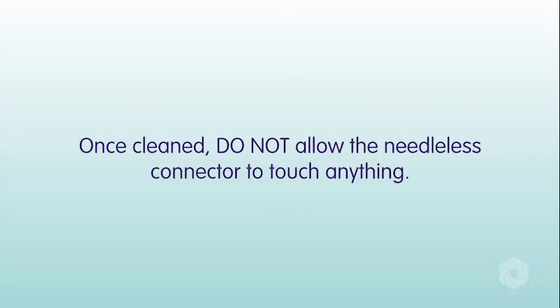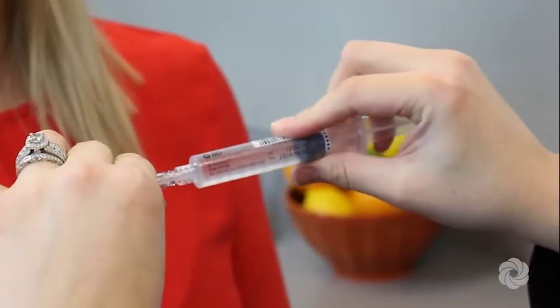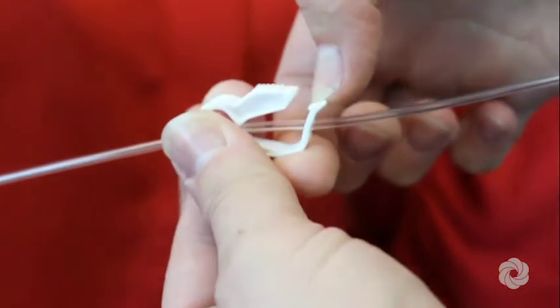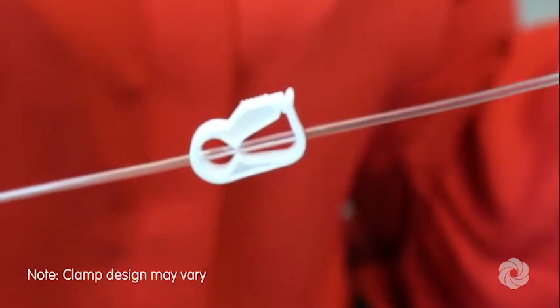Remove the protective cap from the saline flush syringe. Attach the saline flush syringe to the needleless connector using a push and clockwise twisting motion until secured together. Open the clamp on your IV catheter and/or IV extension set if indicated.